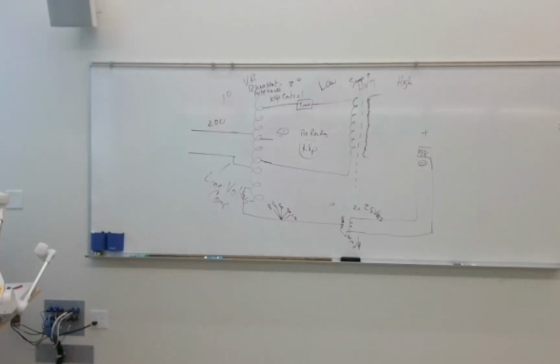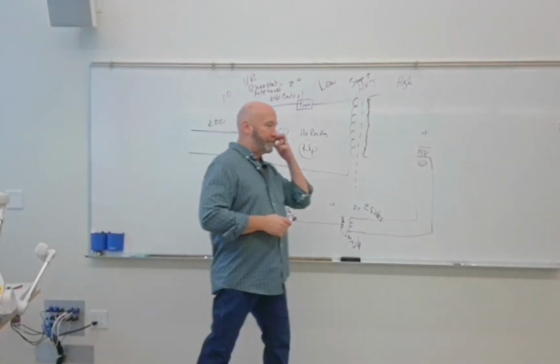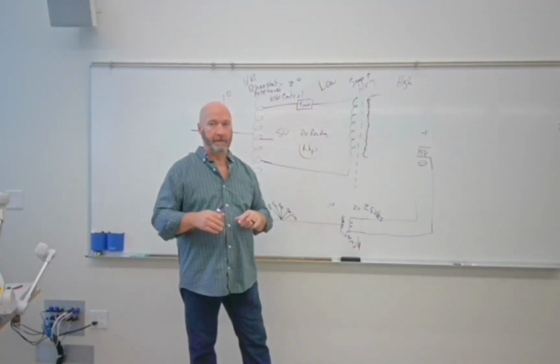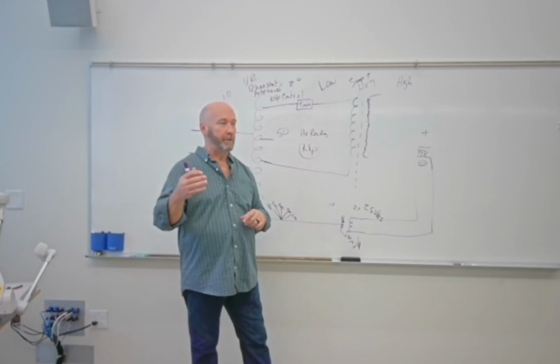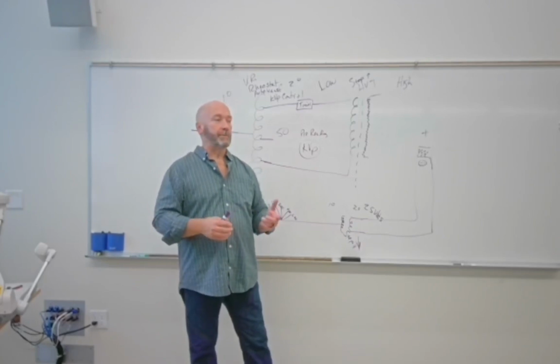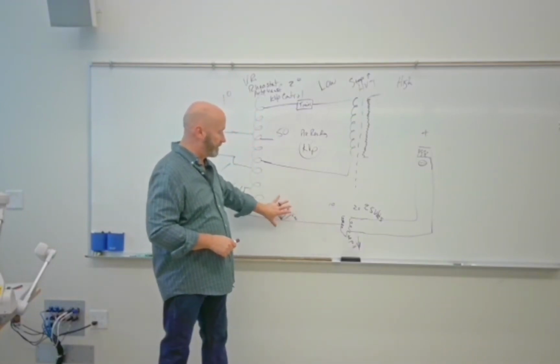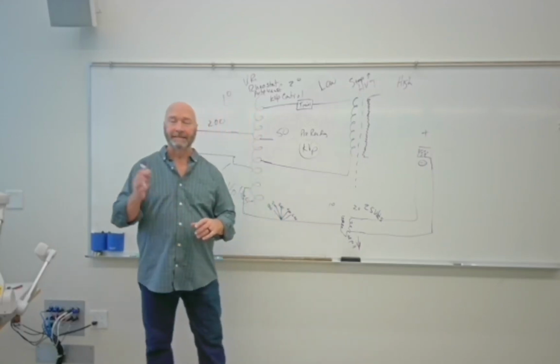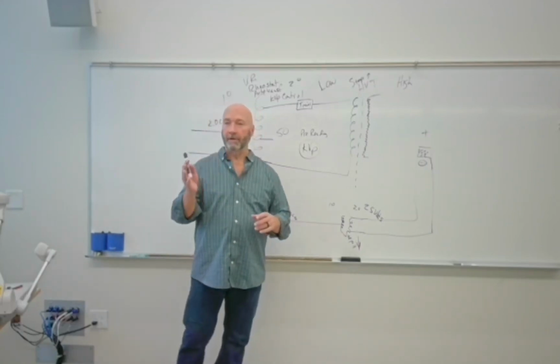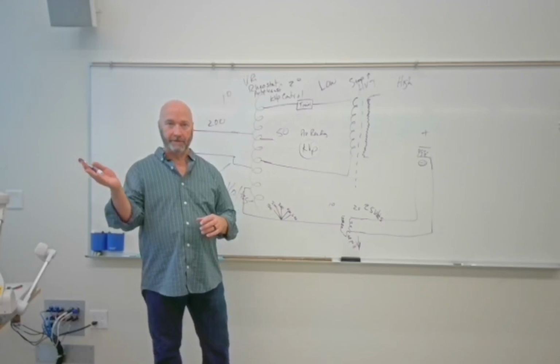So a couple of other things that we just need to touch on. One other thing is the falling load generator on page 100. If you ever work in places where they need really rapid exposures, what they refer to as serial exposures, like in special procedures, cardiac catheterization, they have a special mA circuit, and what it does is that whenever they start an exposure, it starts with naturally the highest possible mA station.